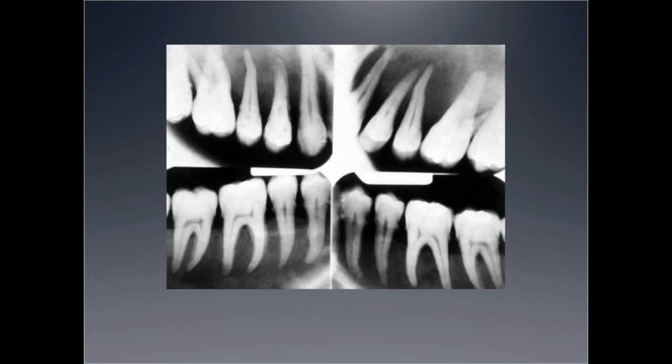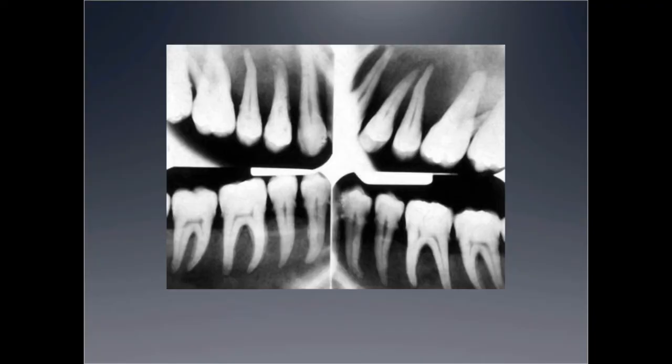Now, in the weird and wonderful category, you can't really possibly have a periapical lucency on every tooth in the oral cavity. Well, potentially, I guess you could, but there has to be a reason for it. That's right. And so, in this case, we have periapical lucencies, and we also have a singular finding in all 4 quadrants, complete loss of lamina dura.